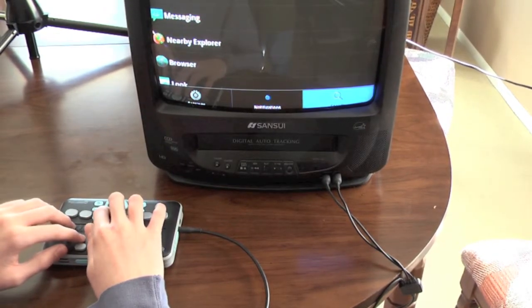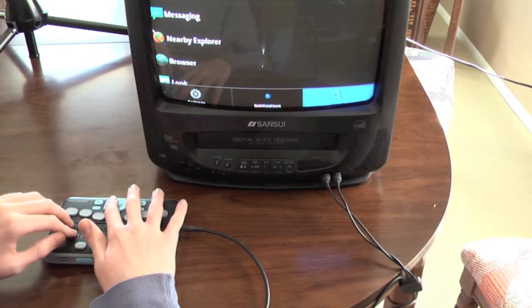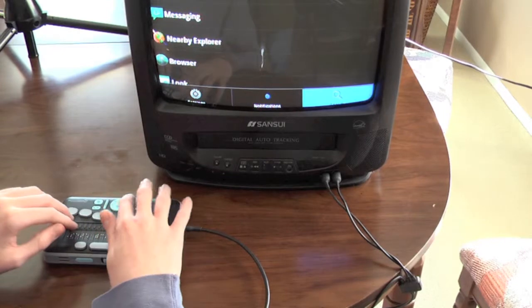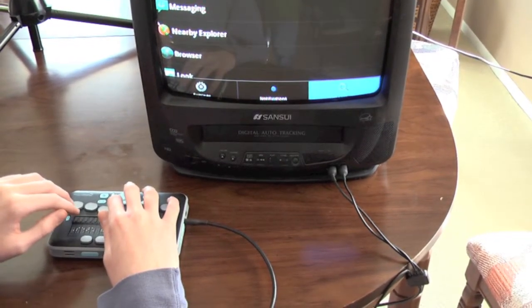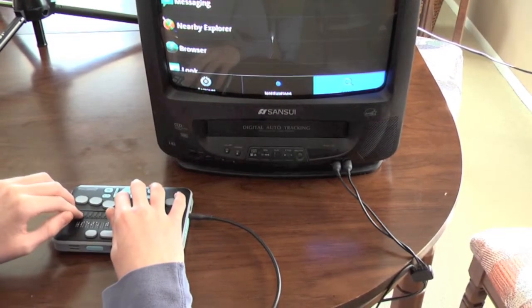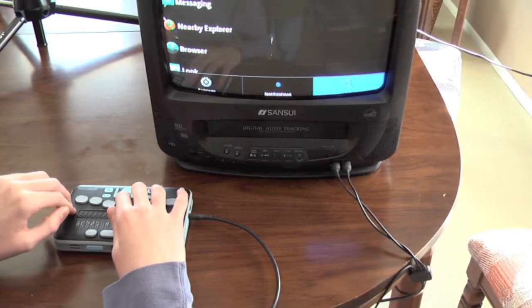So as soon as you press the menu key, in order to move between options, you must use the left and the right arrow keys. Now, in some programs, for example in the word processor, you will have submenus, meaning that once you get into this menu, you can choose certain options to see even more choices. For example, you might have menus for File, Edit, Tools, etc.